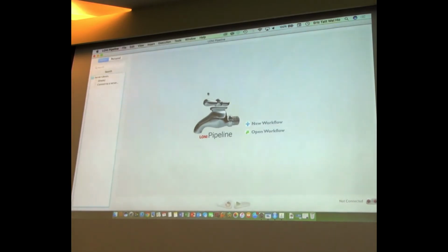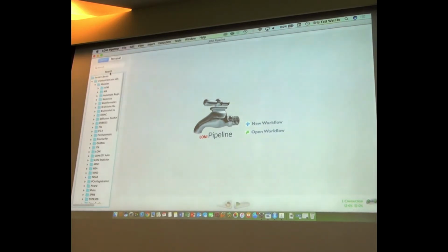So you see the main canvas where stuff is going to be happening, and a server library which is empty because I have not connected to any server yet. But I can click down on the bottom and connect to the free guest account server. So it's authenticating, done, one connection. So you see how it's updating the collection of known modules and libraries from the server. So we have three types of objects here.